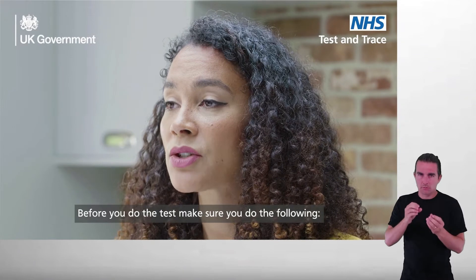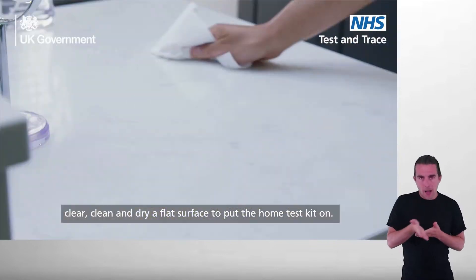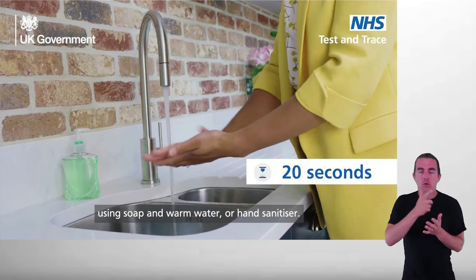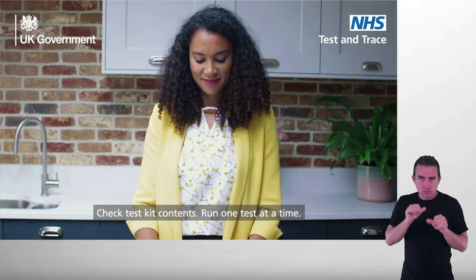Before you do the test, make sure you do the following. Immediately before performing the test, clear, clean and dry a flat surface to put the home test kit on. Wash your hands thoroughly for 20 seconds using soap and warm water or hand sanitizer. Check test kit contents. Run one test at a time.